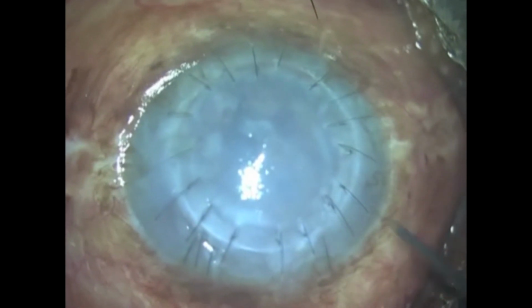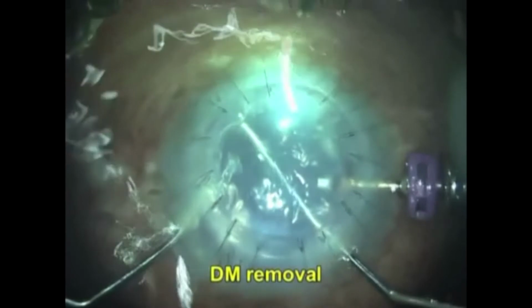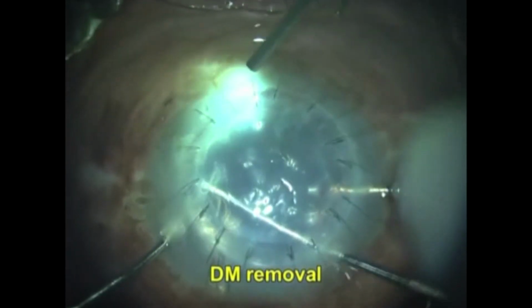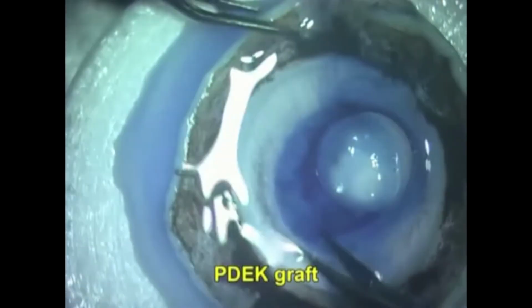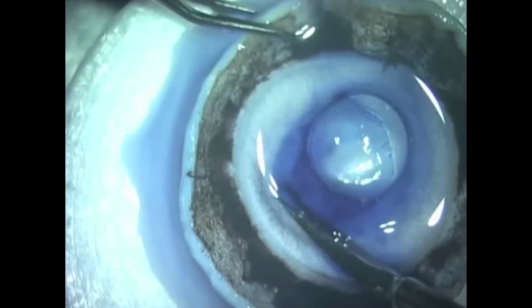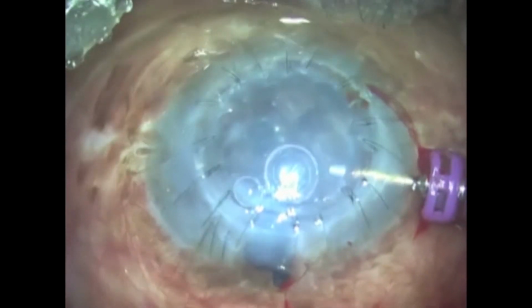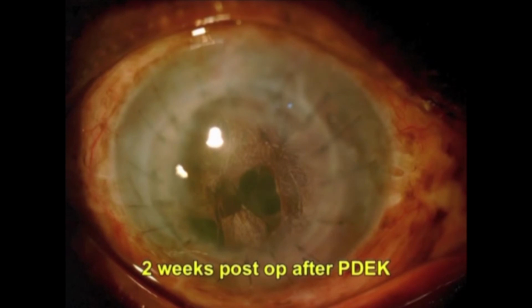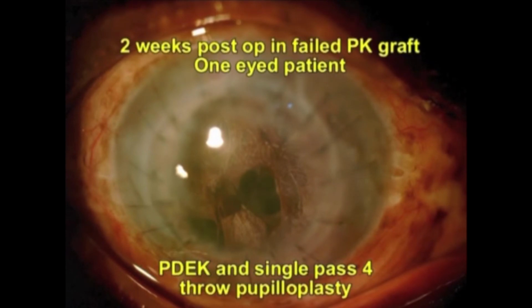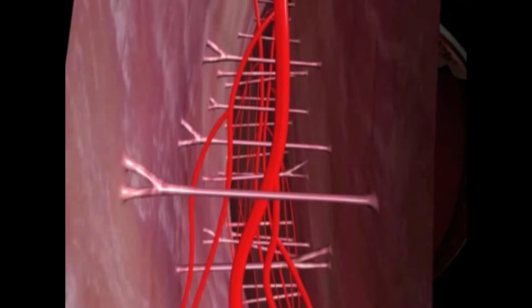Pupilloplasty is a great arsenal in treating patients with Urrets-Zavalia syndrome. It can be combined with pre-Descemet endothelial keratoplasty or any endothelial keratoplasty technique in patients with failed penetrating keratoplasty and having Urrets-Zavalia syndrome. The single-pass 4-throw pupilloplasty followed by pre-Descemet endothelial keratoplasty can be performed in the same sitting.